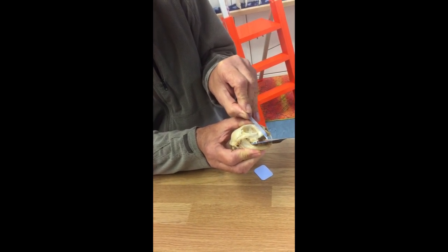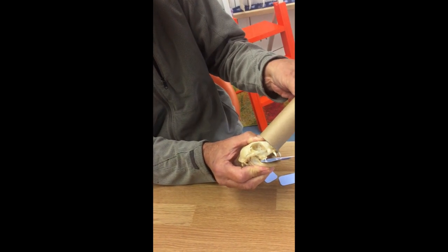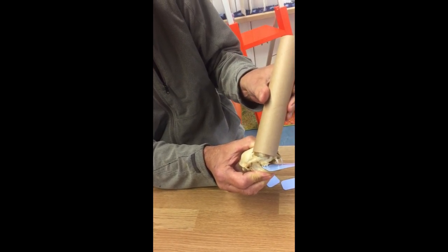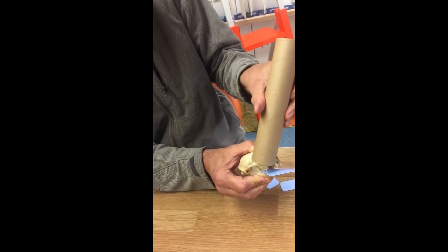Now forget all this story about bisecting angles, get the head of your x-ray machine and line that up there. So we then, having got that in your mind's eye, simply halve that angle with your cone and then just up it about 15 degrees.